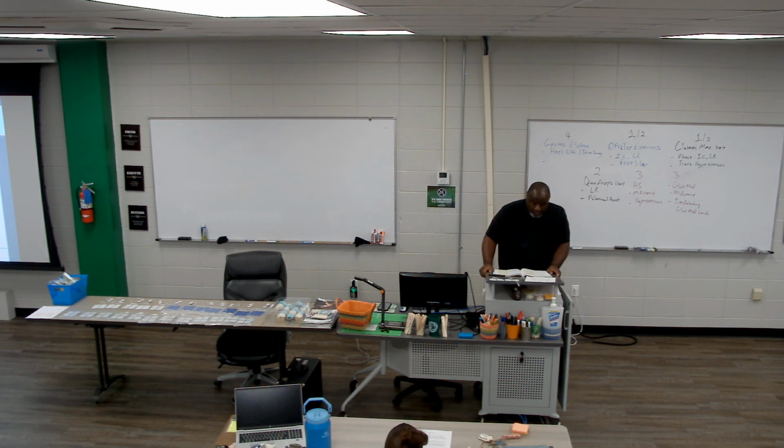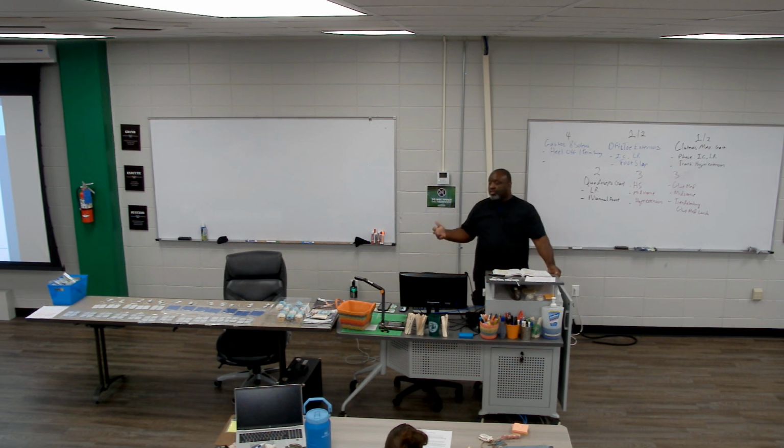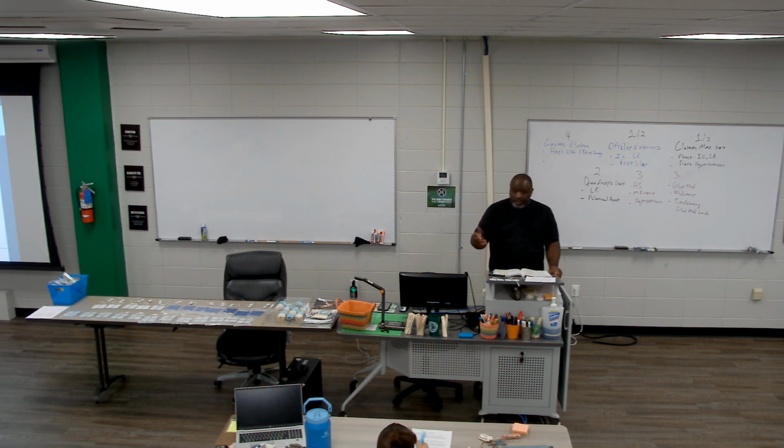It says frequency is pulses per second, the number of pulses delivered to the body within 1 second. So your body won't discern how many. It'll be something you'll have to look at on the screen or look at when you're doing it, because it's going to happen really fast.